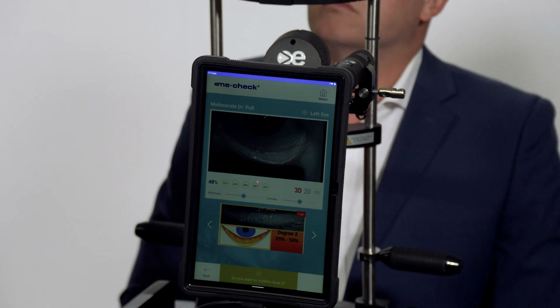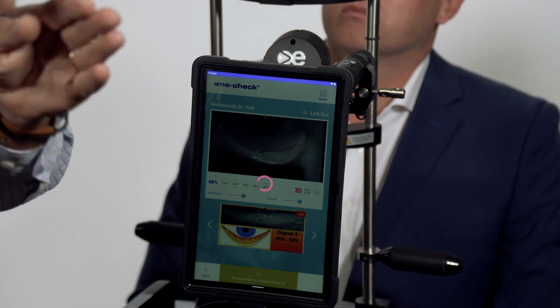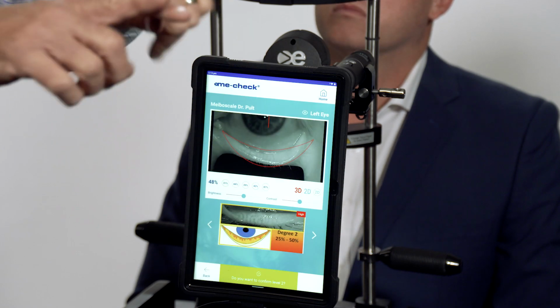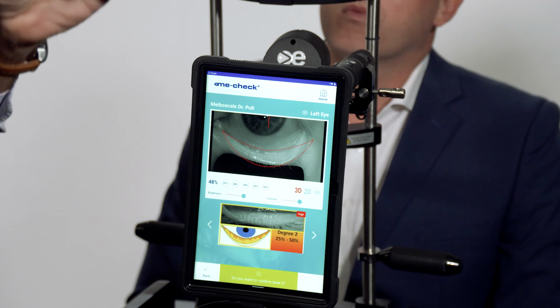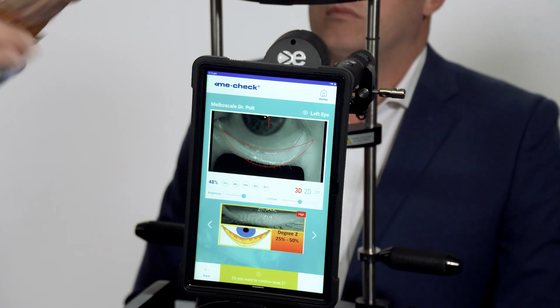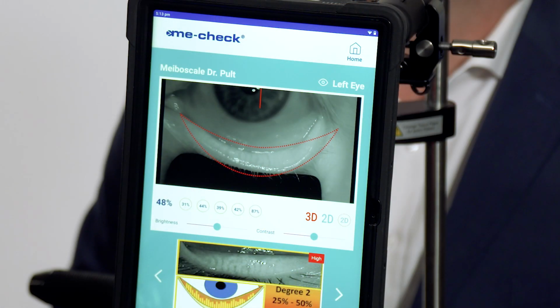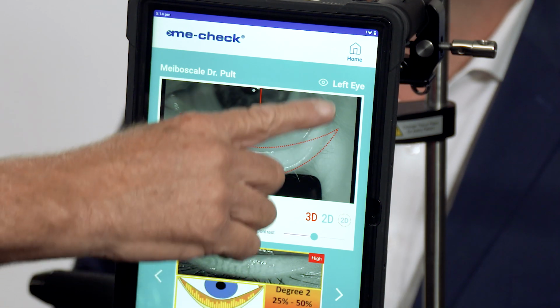So when you're looking at the glands themselves, you want the lid to be down and you want it to invert. And you should be able to, just with your physical eye, look and see these white glands that move up and down. They're side by side and they're vertical. And if you can see those impressionistically, you should be able to get a good picture here.